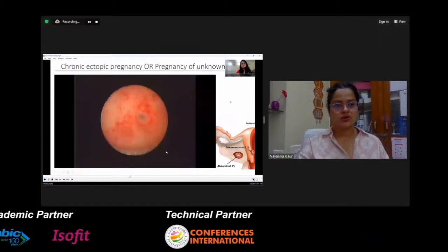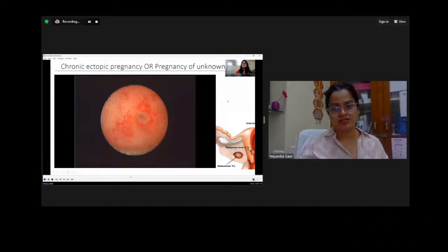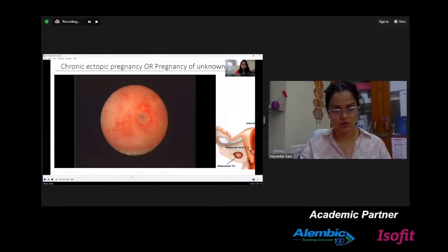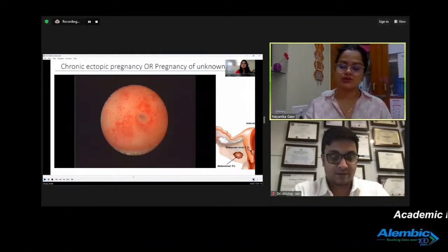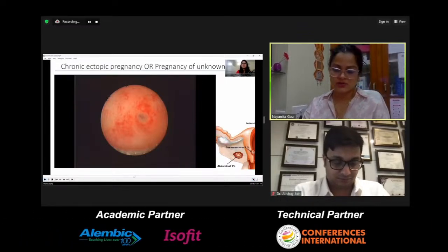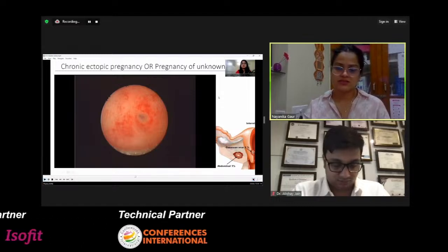Now, this is a case of a chronic ectopic pregnancy, or pregnancy of unknown origin, or the abdominal pregnancy. This patient had come with a beta HCG report showing pregnancy, but there was no ultrasound evidence of pregnancy, intrauterine or extrauterine. So, we decided to take this patient for a diagnostic hysterolaparoscopy to understand where this pregnancy test is coming positive from.